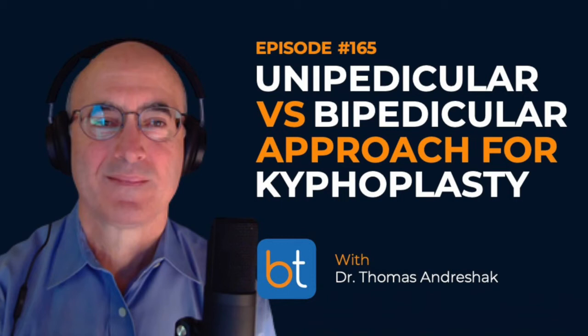Well, as an orthopedic surgeon in training of fractures, that's how I base it. Fracture principles based on the AO principles is, you've got to have fracture fixation anatomically. Then you have to make sure that you do it as a soft tissue sparing approach, which vertebroplasty and vertebral augmentation is. You want to mobilize the patient safely, but you also want that stability. The question is absolute stability or relative stability. And that goes back to, again, difference between colleagues in orthopedics and neurosurgeons. We believe in the bone. Be the bone. We own the bone.